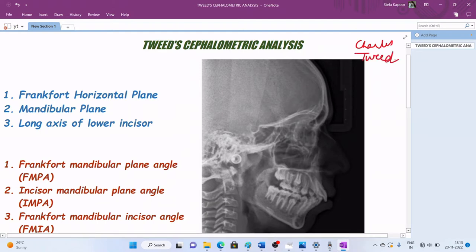This cephalometric analysis consists of three planes. First is the Frankfurt horizontal plane, mandibular plane, and the long axis of the lower incisors. But before we trace these planes, it is important that we look at a few cephalometric points which we will need in this analysis.